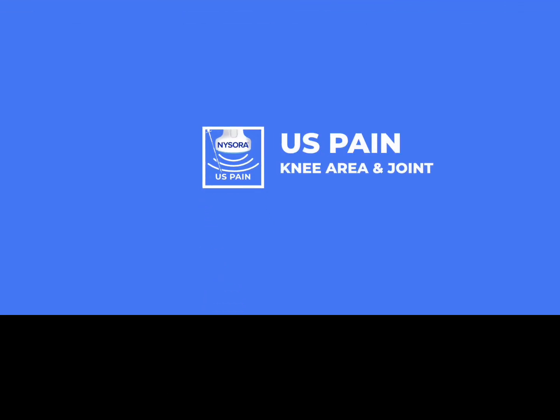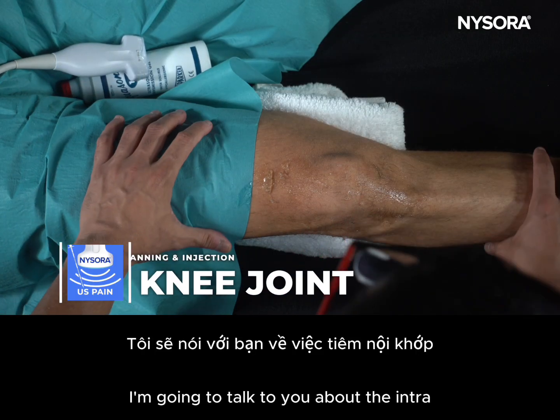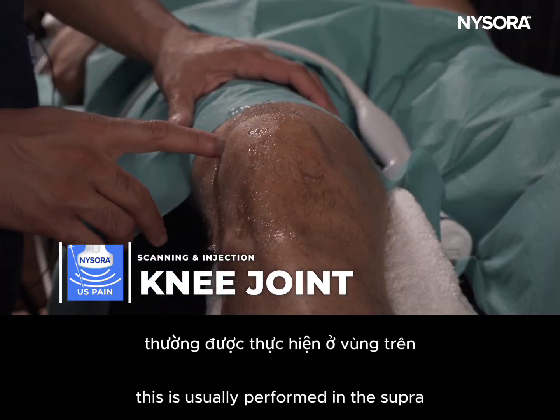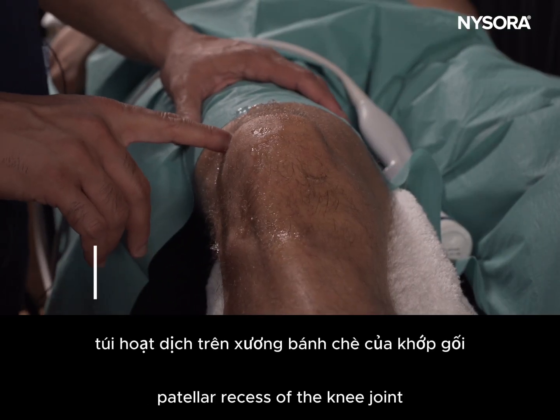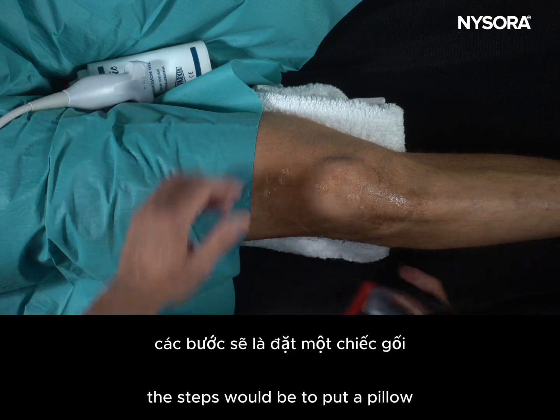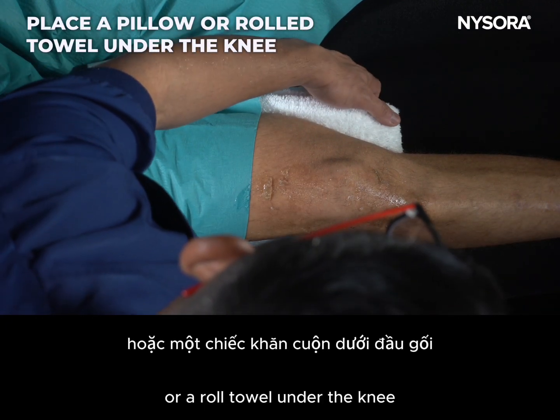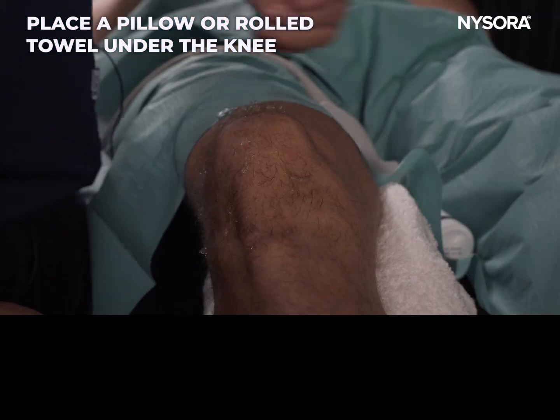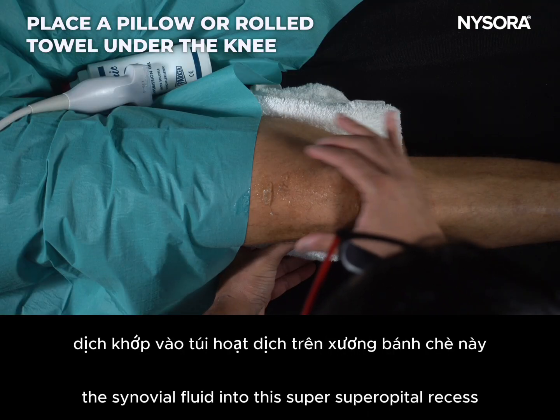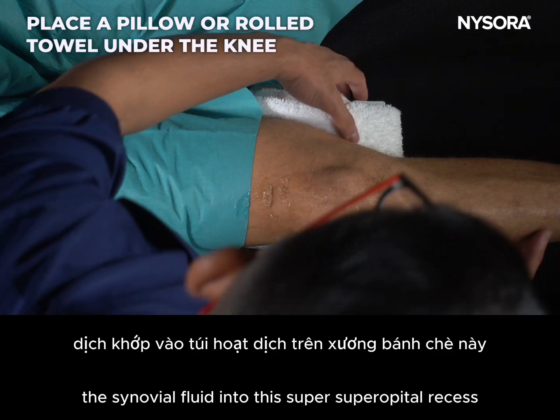Thank you. I'm going to talk to you about the intra-articular injection of the knee joint. This is usually performed in the suprapatellar recess of the knee joint. To perform this injection, the steps would be to put a pillow or a rolled towel under the knee. This particular maneuver helps to pull the synovial fluid into this suprapatellar recess.